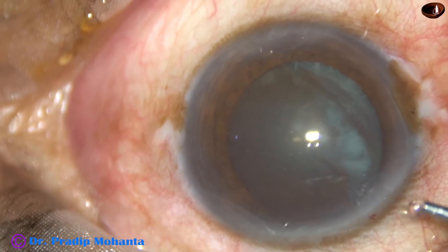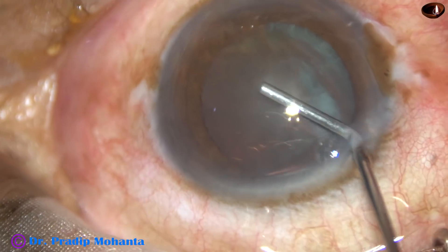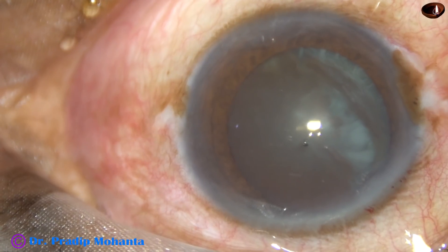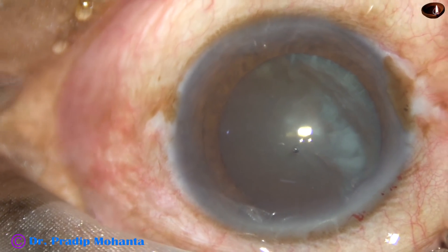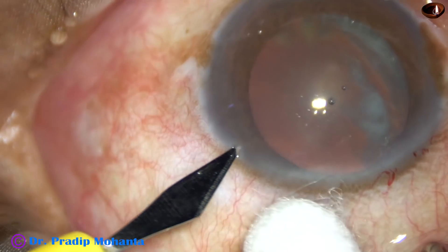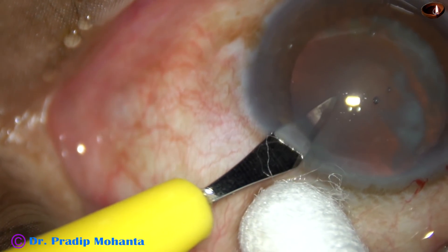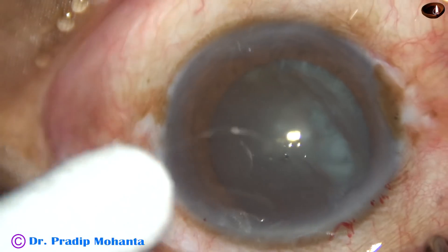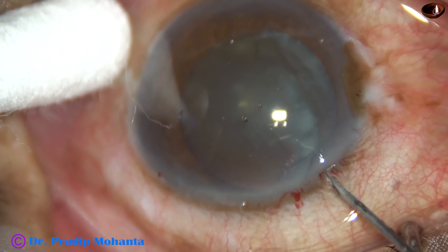By this time, the main incision has been made. 2% hydroxypropyl methyl cellulose is injected into the anterior chamber, and then a side port — only one side port — is being made, in this case on the left side of the main incision, about 2 and a half o'clock hours away.